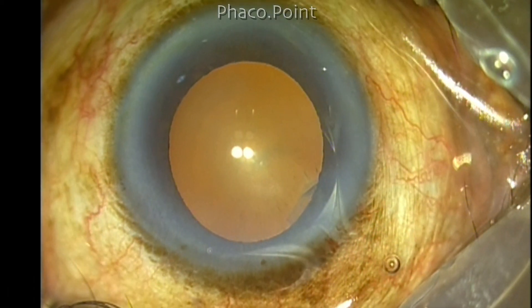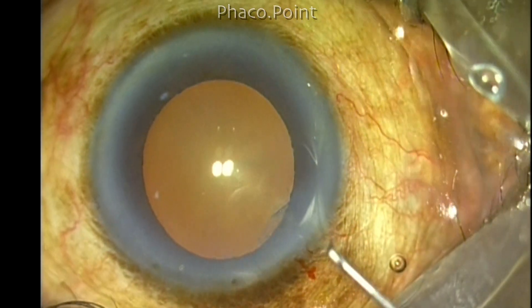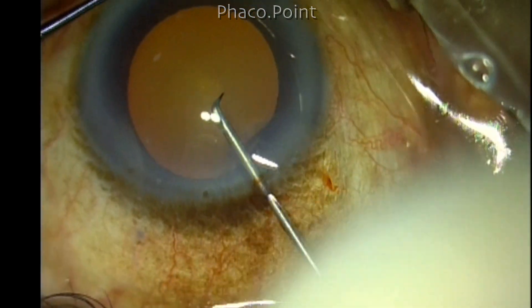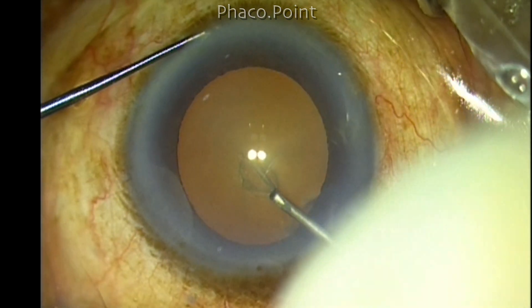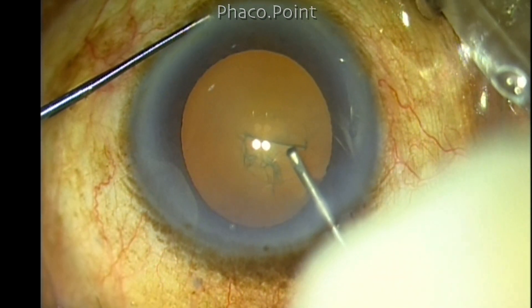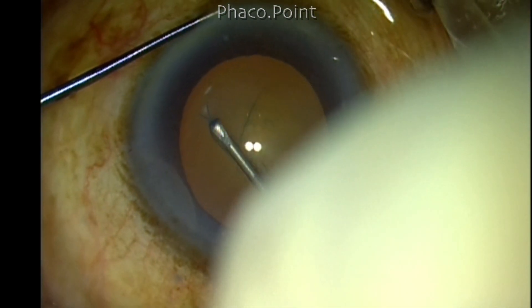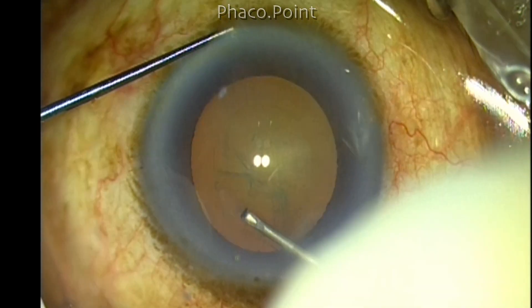In this patient, the pupil size was only around 6 millimeters, so I tried to use the pupil as a template in order to create my 5 to 5.1 millimeter capsular rhexis. With the help of a cystitome, I make the initial central puncture and create a C-flap. I'm doing this very cautiously, trying to keep the edge of the capsular rhexis just about 0.5 millimeters, running parallel to the pupillary margin, and trying to keep it central as well as round.